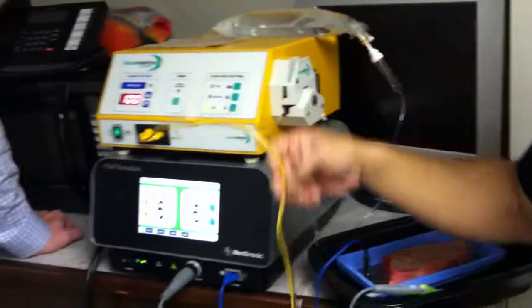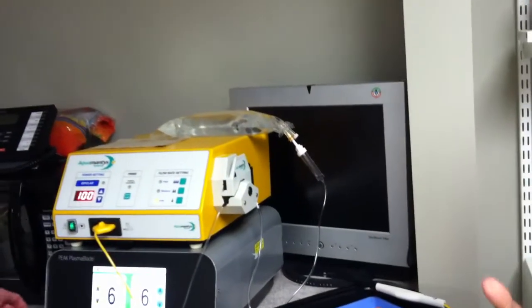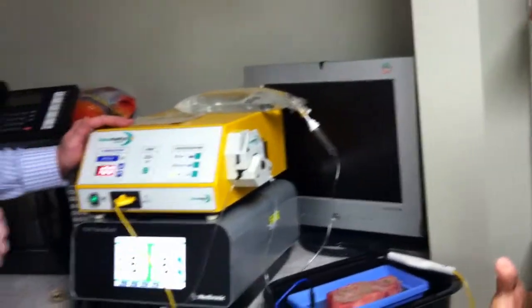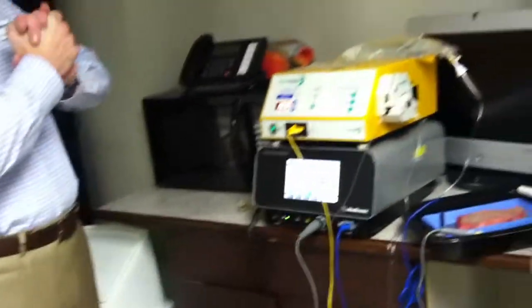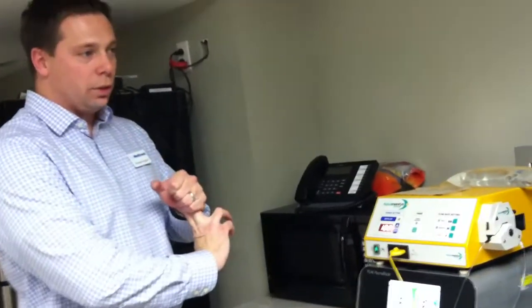Yeah, exactly. Just make sure the staff knows. It seems like there's more tubing here that they have to be responsible for, to make sure this is hooked on right. If there's no water flow, what happens? It just doesn't work. It just operates at a bipolar setting. So it'll just be like a big bipolar. What I always tell the staff is the priority: when you're going to throw the Bovie on, you need to throw the Aquamantys on too, because you're going to use it immediately.